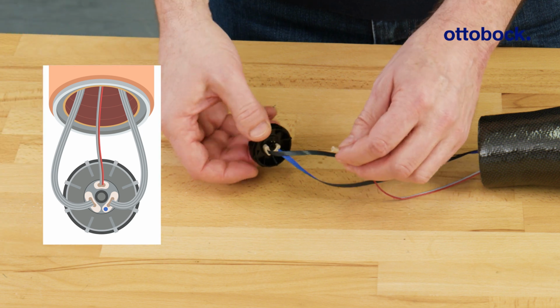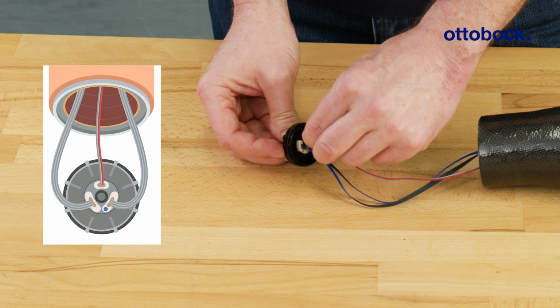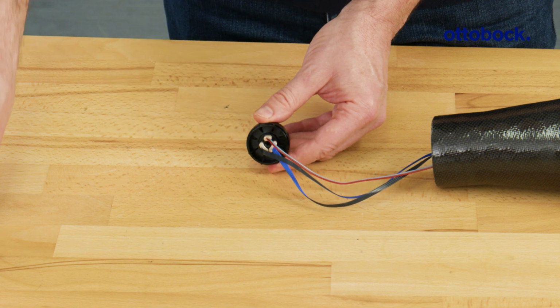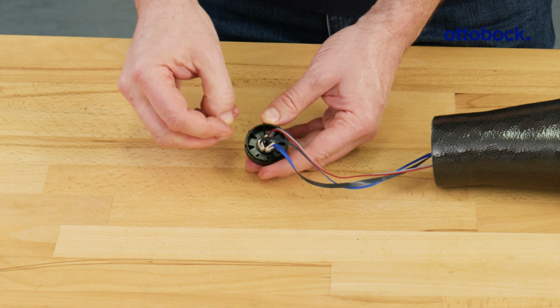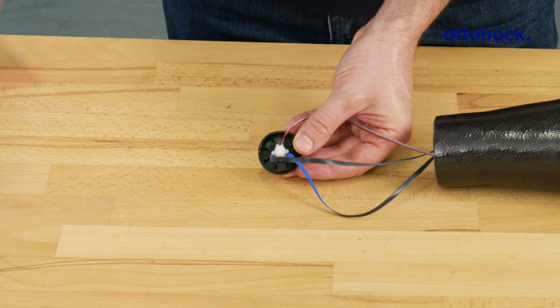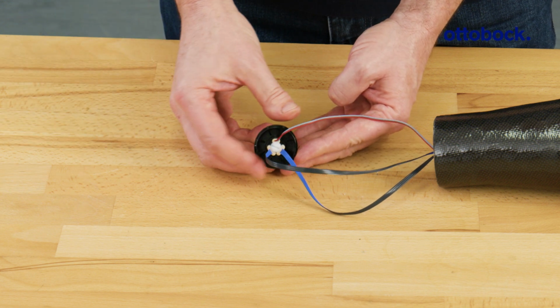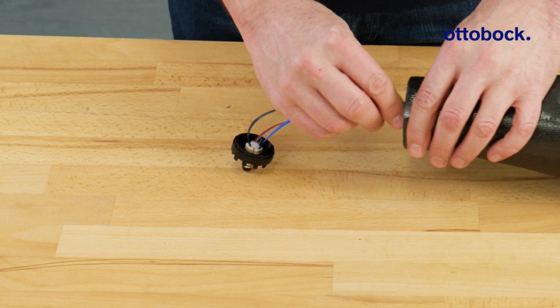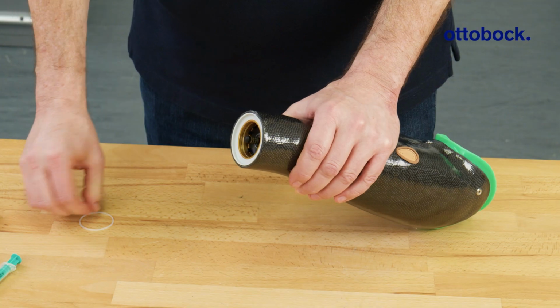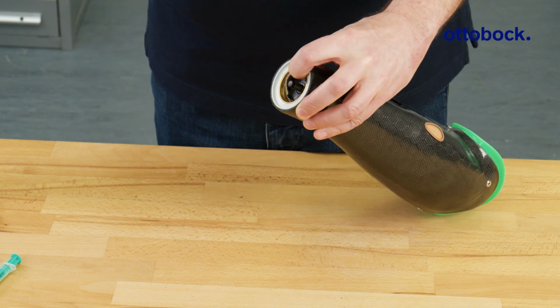Plug the 2-pin cable of the power supply into the 2-pin contact at the top. Secure the cables to the coaxial plug using the white plastic screw. Finally, use the lock ring 11S4 to secure the coaxial plug in the lamination ring.